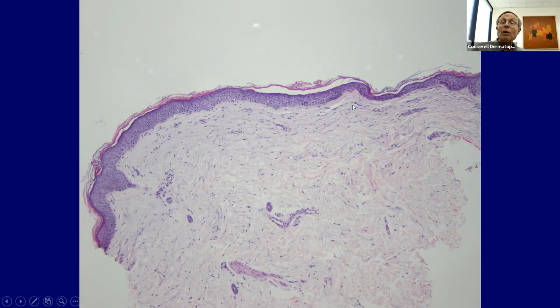Well, there are sparse infiltrative cells, might be urticaria pigmentosa. Let's look, are there melanophages? Is it a pigmentary process? Let's look at the epidermis. Is there any melanin there? Maybe it's vitiligo. Maybe it's some kind of hypopigmented disorder. Maybe it's pityriasis alba. Let's look at the cornified layer. See if there's any abnormality there. Sometimes you get tinea with minimal inflammation. Maybe it's tinea versicolor. Maybe something applied exogenously to the skin.